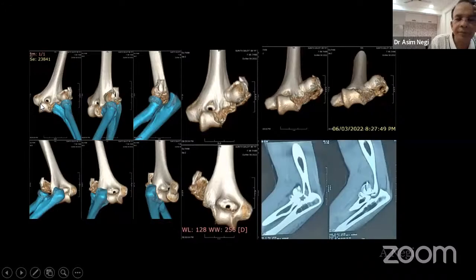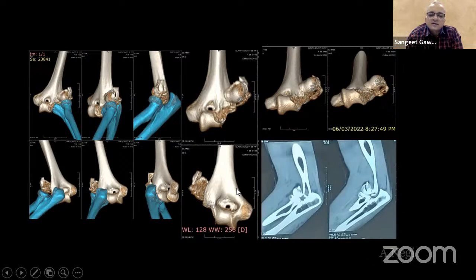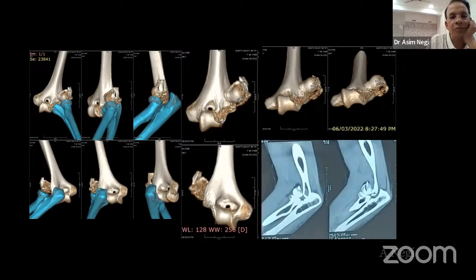And you can see that the olecranon fossa is more or less intact. So posterior approach is out. Here, if you have to reconstruct the capitulum, you cannot use a lag screw. Somebody was asking, why do we need a buttress plate? Here you need to put a posterior plate on which you can fix the capitulum. Is it clear now? Yes, sir. Very classical case. Asim, you can go ahead.